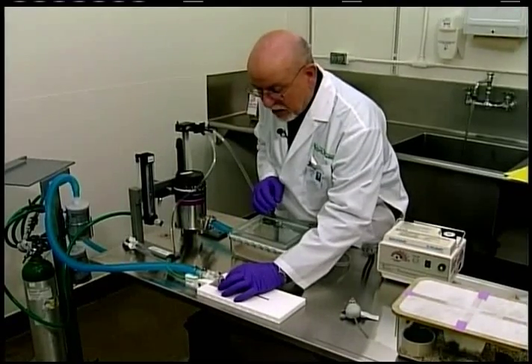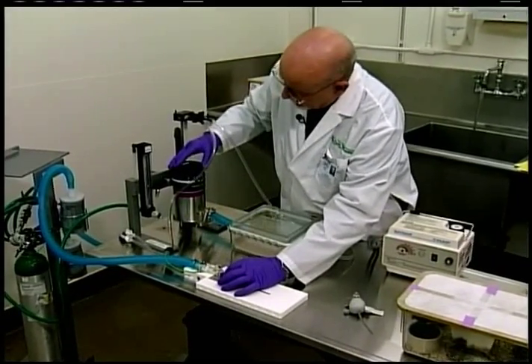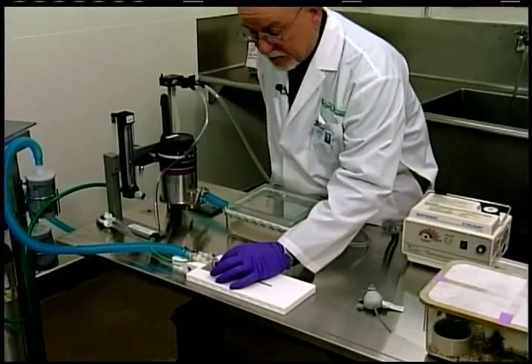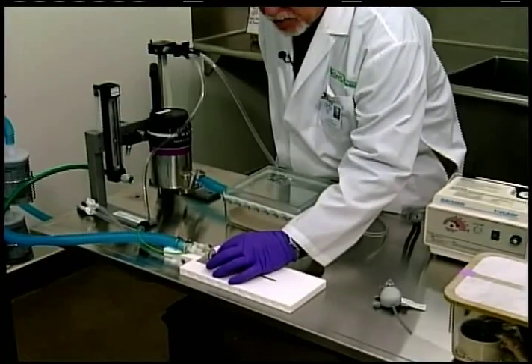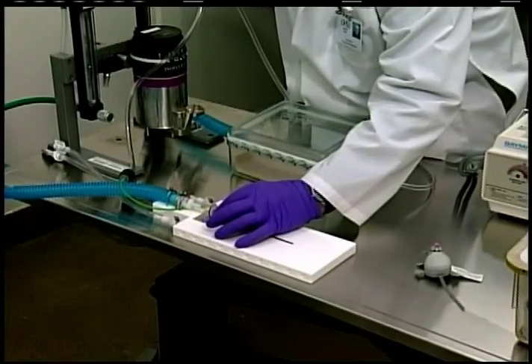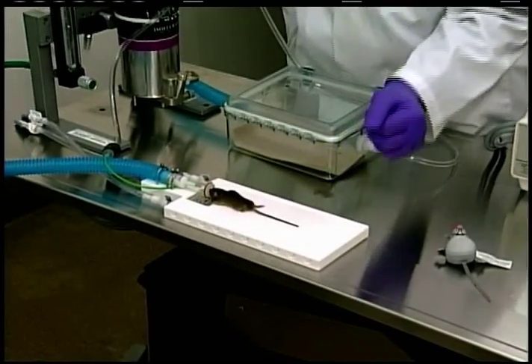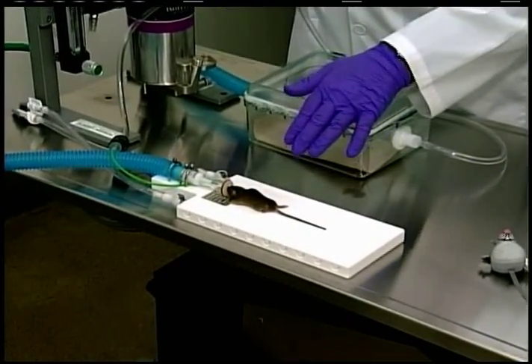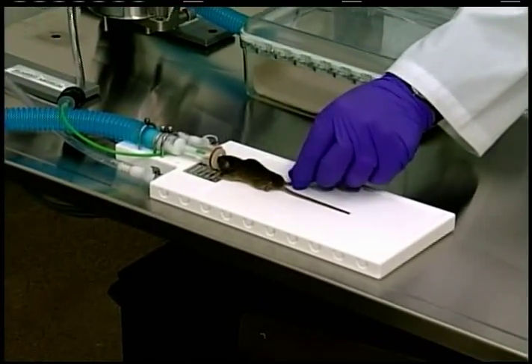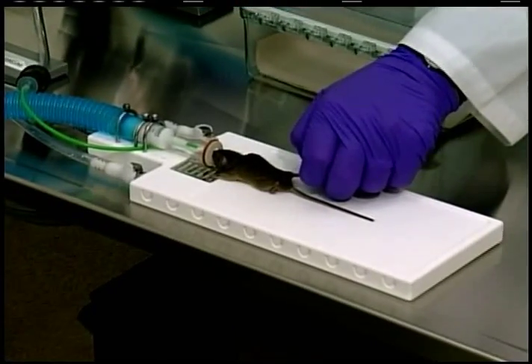And it may take just a moment for him to equilibrate again because he's been allowed to breathe room air for the last 15 seconds or so. I just want to make sure that his muzzle is approximated properly in the non-rebreathing system. And I want to make sure that he's anesthetized, and I'm watching his breathing pattern, and I'm watching his movement. And there's another thing we can do, and that's the toe pinch reflex.